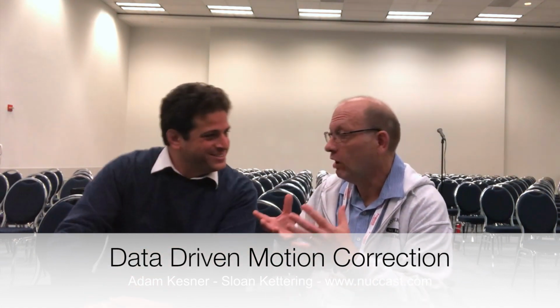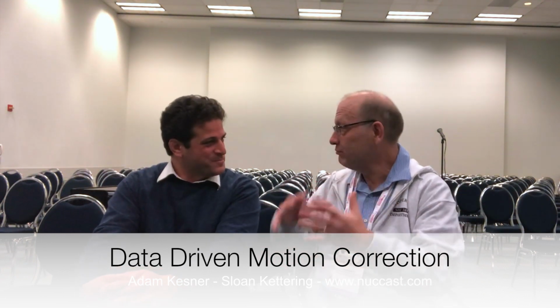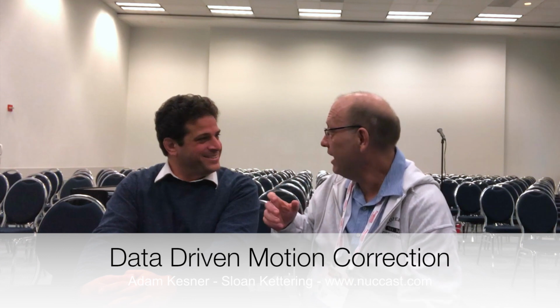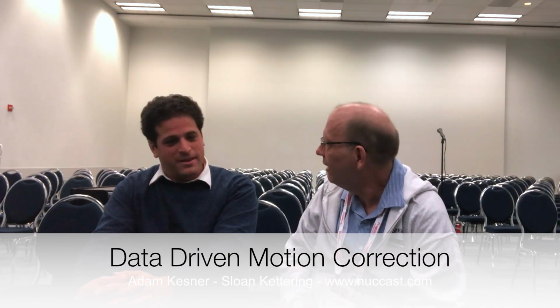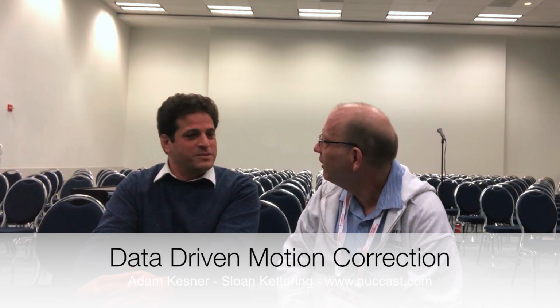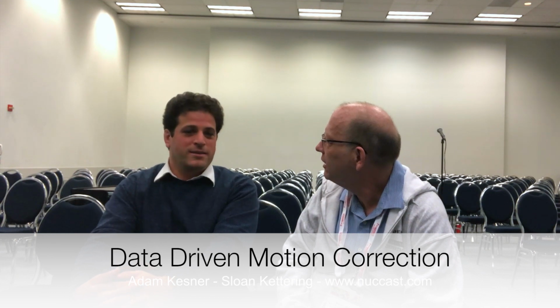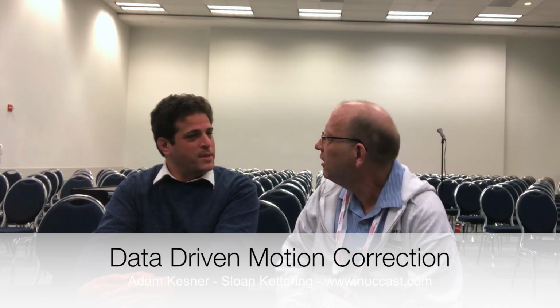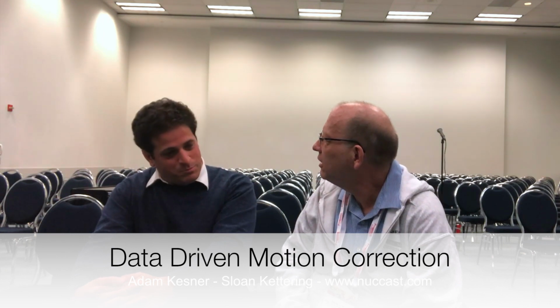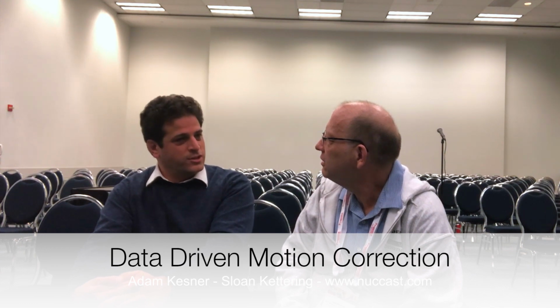Right. Well, from experience, I can tell you, I've seen patients with sleep apnea, for example. And they fall asleep during the scan, and they do a big breath, and it moves a huge amount. And then it totally affects the image. So I would say motion is a personalized problem, and therefore we need to find a personalized solution. And that is part of my motivation for working with data-driven motion correction.